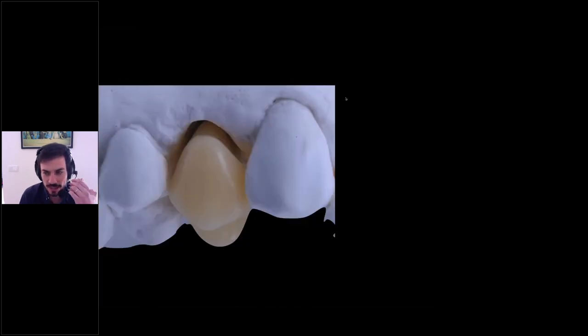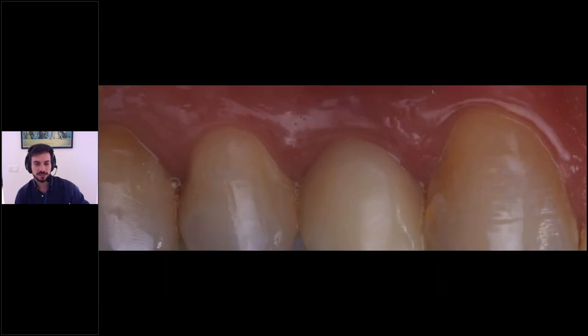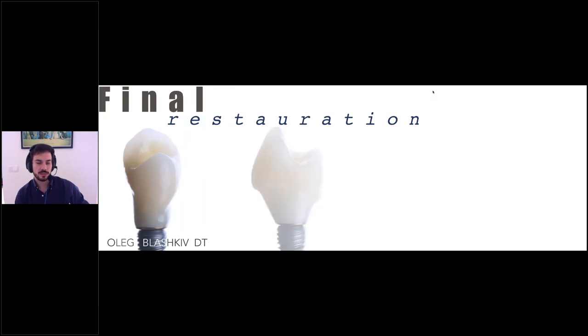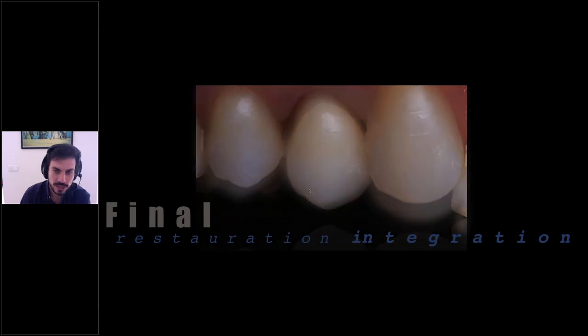In this case, we ask our lab for a second provisional. And then after the second provisional, we are able to have some integration of our restoration like this, and the final restoration in one ti base, a zirconium restoration bonded on one ti base with the under-gingival part always super polished zirconium and above with ceramics.